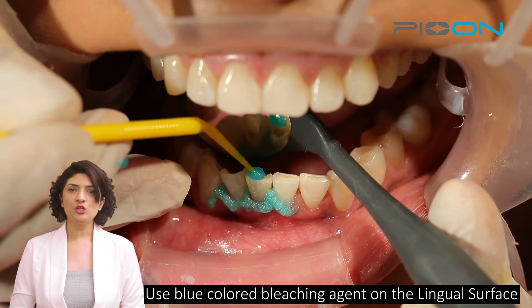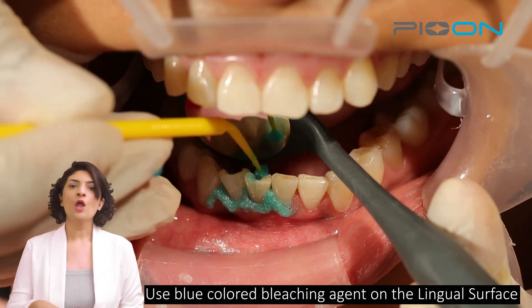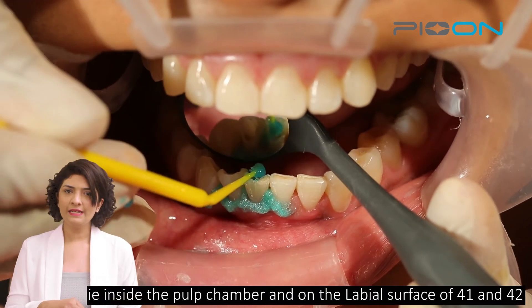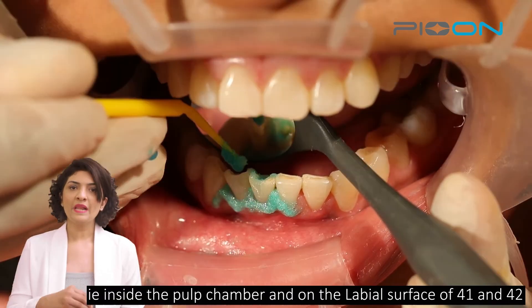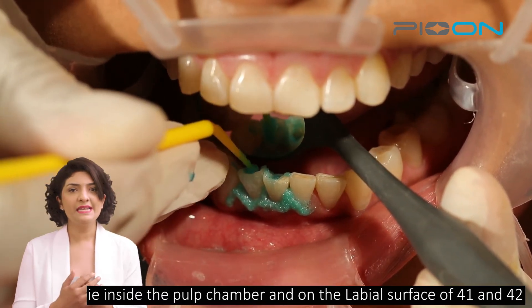After which, we will use blue colored bleaching agent on the inside in the pulp chamber and on the outside labial surface of the lower anterior.